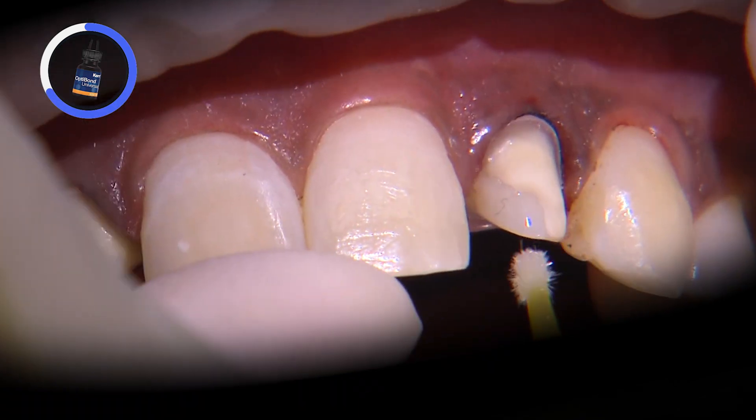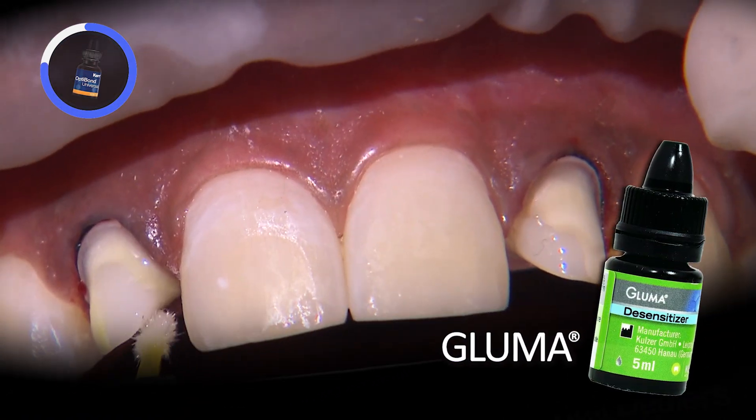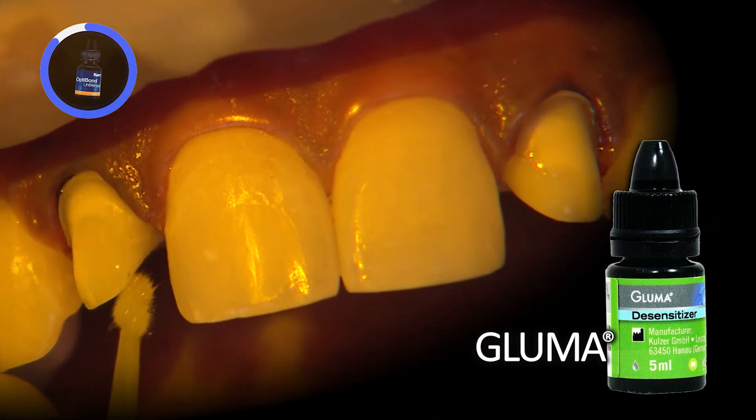To disinfect the preps, I apply a very thin coat of Gluma, carefully avoiding the soft tissue. Any excess can be removed with high-speed suction or a dry microbrush.